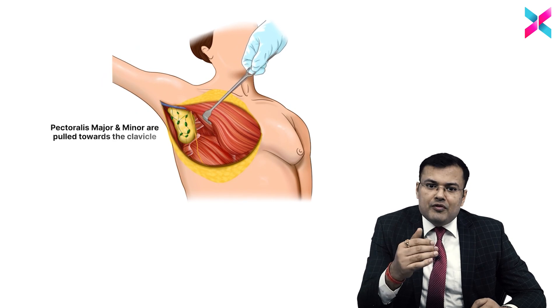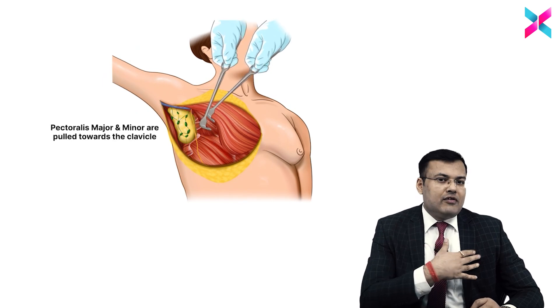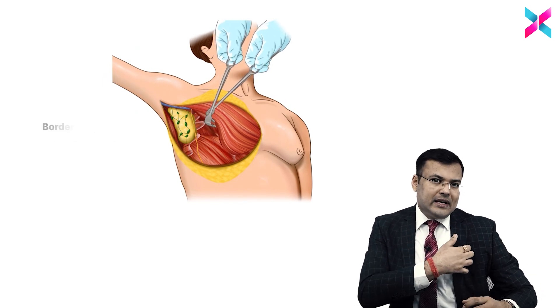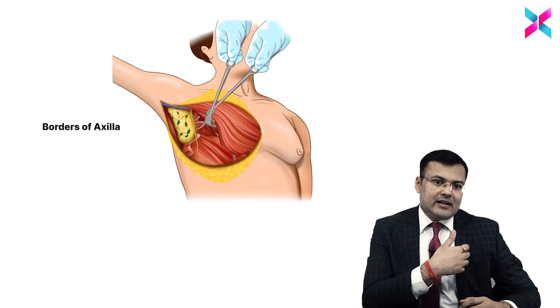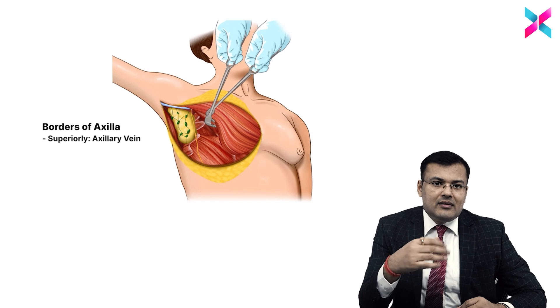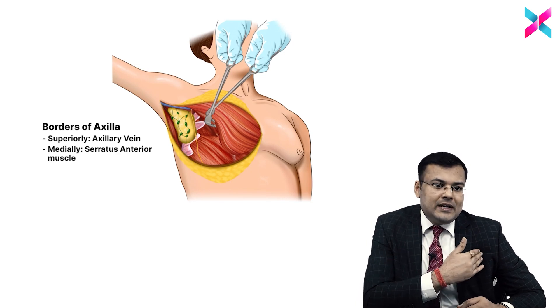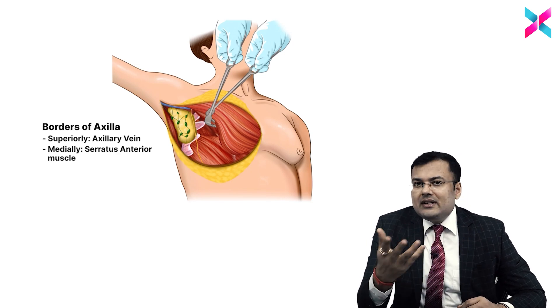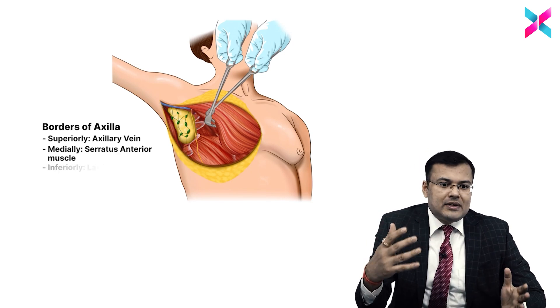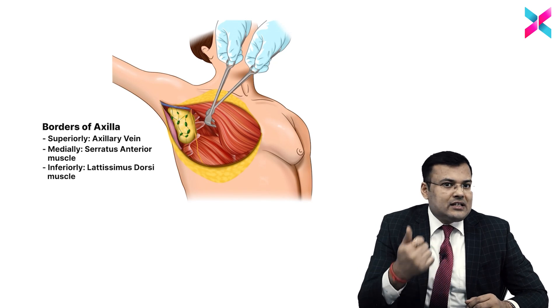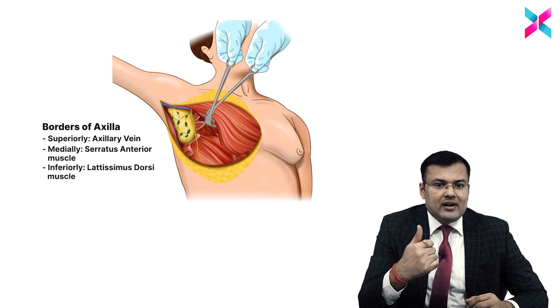Apart from this, for removal of lymph nodes, you can see that pectoralis major and minor have been retracted. See the borders of axilla: superiorly the axillary vein, medially there is serratus anterior muscle, and inferiorly you can see latissimus dorsi.